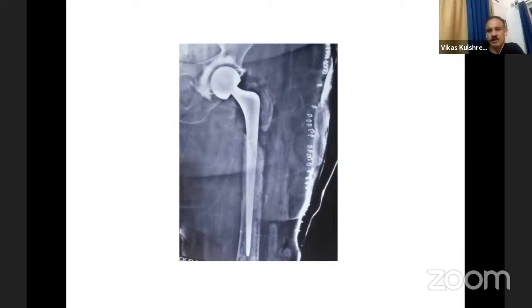Yeah, so just for the audience and the panelists, Link have now introduced their MP reconstruction stem, which also offers a modular cemented option. So you can go short here with a cemented stem and build the body on it, which usually was available for an uncemented version. I have been in the team which used it in Germany, and they use it quite frequently in endoclinic. And I was surprised that they have a modular cemented version. That really helps in such cases with a capacious canal. You can cement in here, and then the body loads the rim also here.